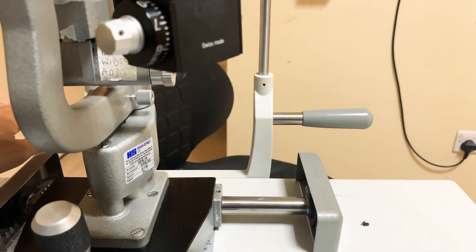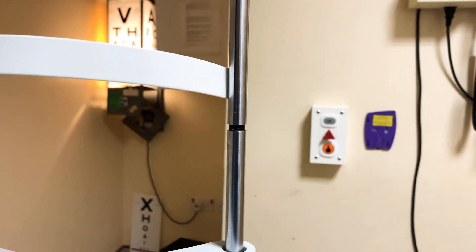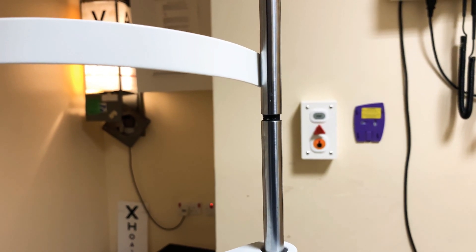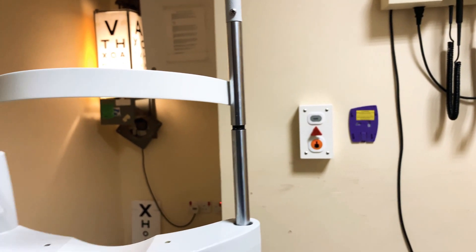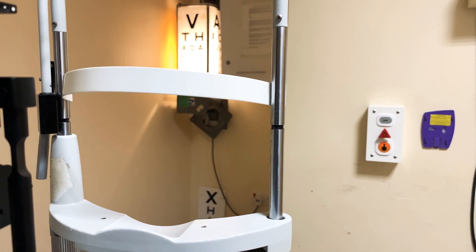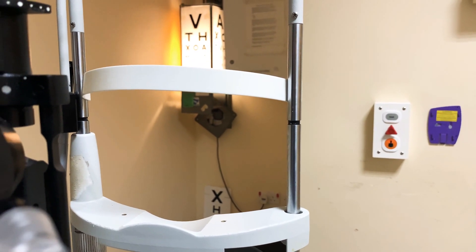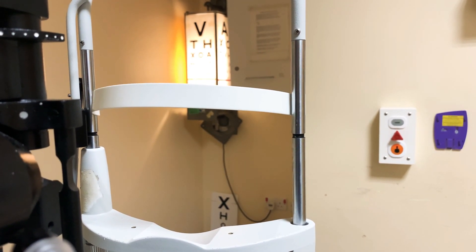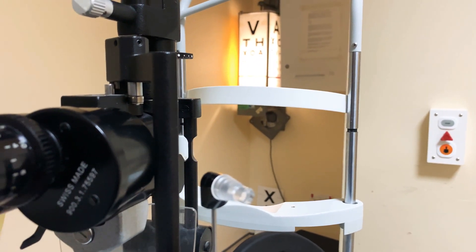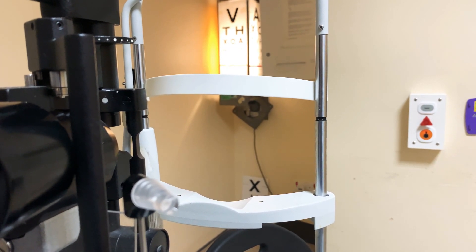When the patient's seated, they can hold the handlebars — really useful for comfort. One important thing: the black line should be aligned to the lateral canthus, where the two eyelids meet. If you're struggling to see, most of the time it's because patients tend to drift away while you're examining. Tell them to keep their forehead pressed against the bar at all times.